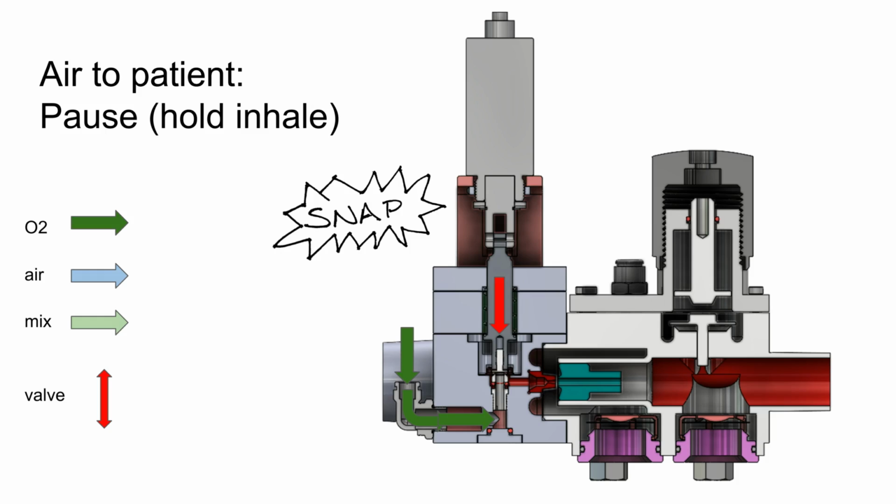Finally, the valve closes again to end the inhalation cycle. Now we're in the pause state, and that's held for a fixed time according to the doctor's program. Now it's time to let the patient exhale.